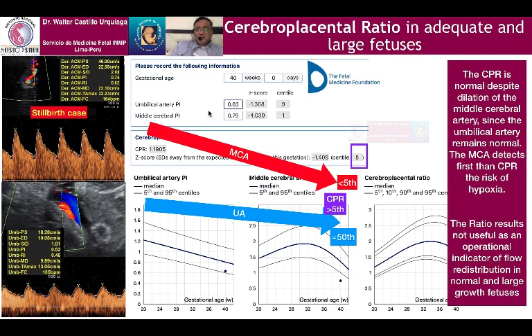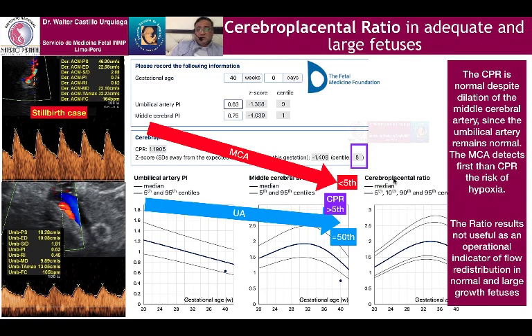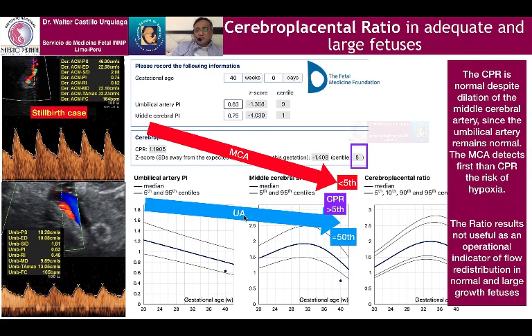In this case, we show umbilical artery in the 9th centile — normal — and middle cerebral artery in the 1st centile, abnormal, very abnormal. But the CPR 1.19 is higher than the cutoff of the 5th centile, the usual cutoff of the 5th centile. So the CPR doesn't detect the risk of hypoxia in this case. It is a case with a large fetus that is already still different. The CPR is normal despite the alteration of the middle cerebral artery, because the umbilical artery — the denominator — remains normal.